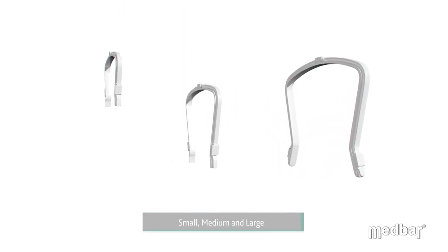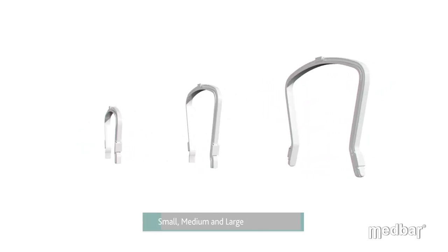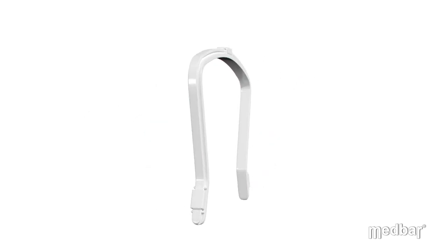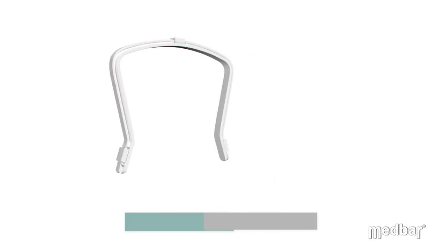The clips come in three different sizes: small, medium, and large. The unique design of the clips allows them to universally attach to a wide range of C-Arm models, from older models that are still in use to the updated modern designs of the C-Arm machine.